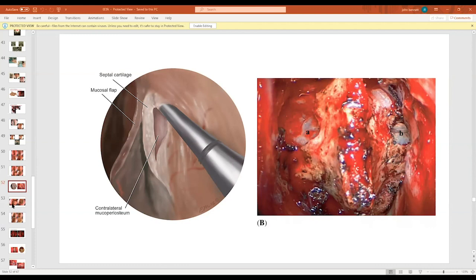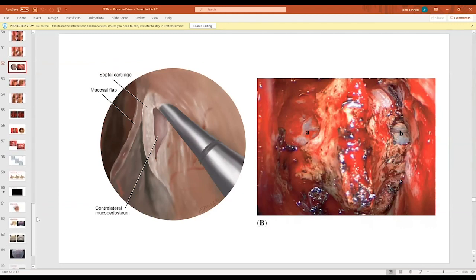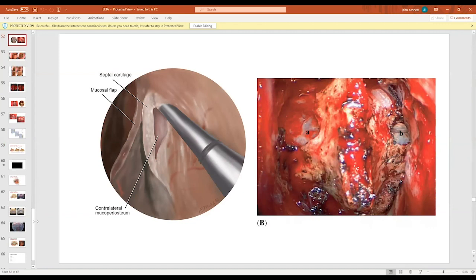Don't go upward. You go upward there, you will make your drilling, you get into the planum sphenoidale, or you get into the ethmoid bone, you have a CSF leak. And if you want to go to the sella, don't go up. Stay in the middle. Use your horizontal line that joins both ostium as your superior landmark. Don't go above it. You go above it, you get into the ethmoid bone, you get into the anterior fossa, you get CSF. Okay, so next slide.